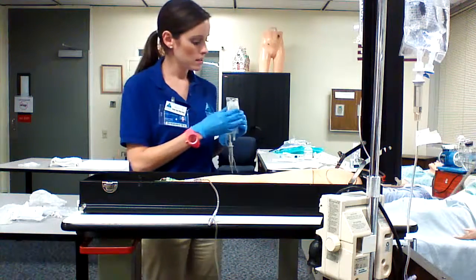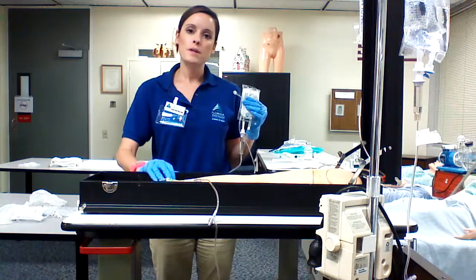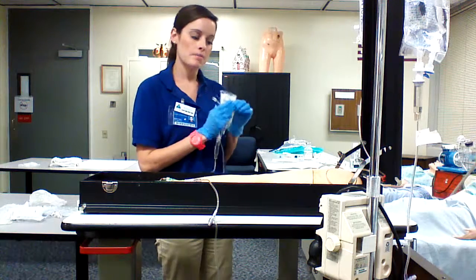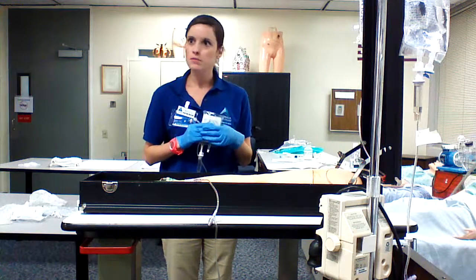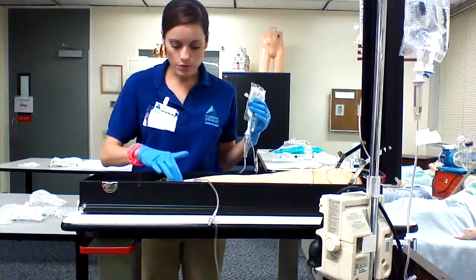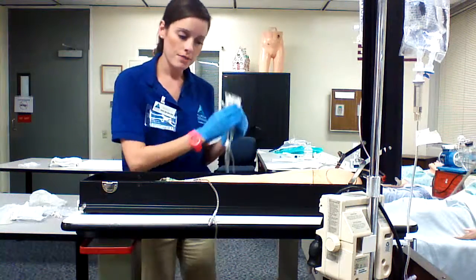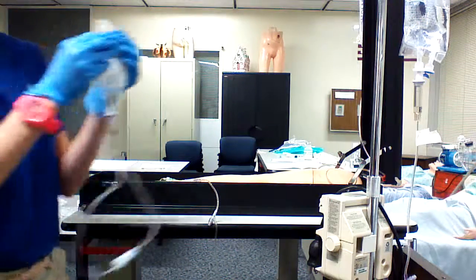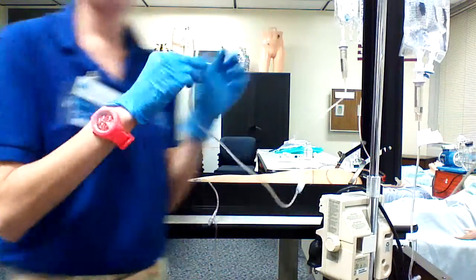Can you go ahead and state your full name for me and your date of birth? Sarah Jones, 5/28/66. Okay, so I have that medication prepared for you. Do you have any allergies that I should know about? No, I don't. Okay, so I'm going to palpate the site for phlebitis or infiltration. There is none. Okay, so I have your medication, so we can treat that infection that you have and help it to go away, okay?